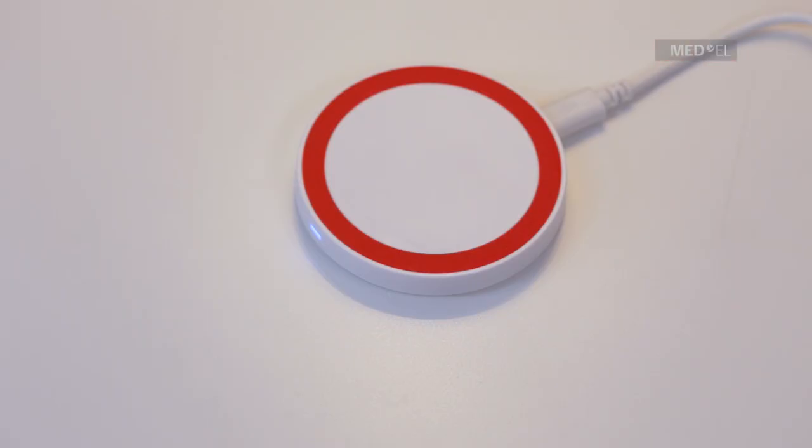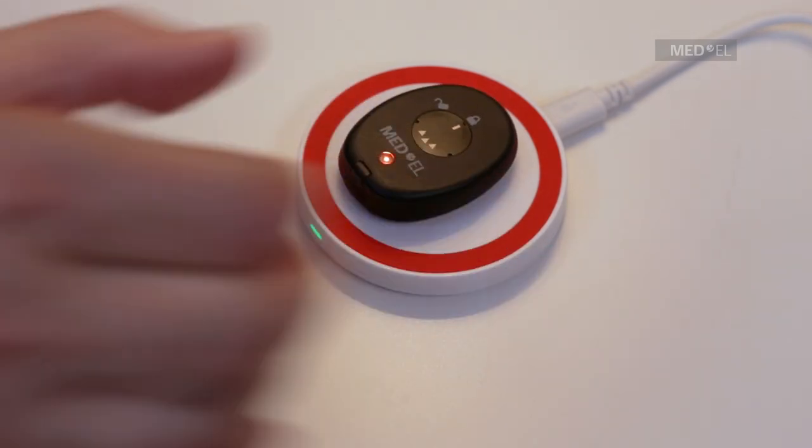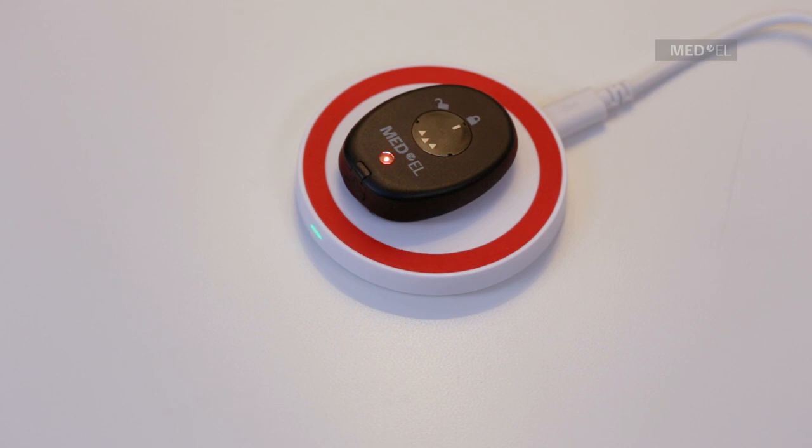To charge RONDO 2, first plug in the charging pad. Place RONDO 2 in the exact center of the charging pad, with the MED-EL logo facing upwards. The orange indicator light shows that RONDO 2 is charging.